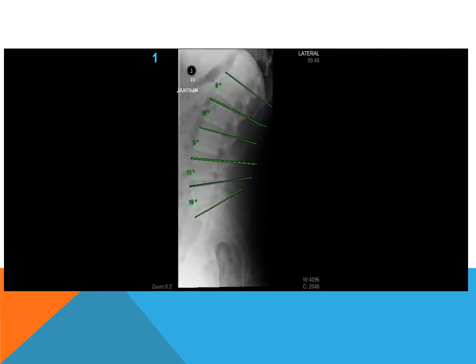So here on the same lateral lumbar radiograph, I measured the lumbar lordosis. It was 60 degrees. I've now measured the intersegmental angles by drawing a line first from the superior end plate of L1 to the superior end plate of L2. That angle measures -8 degrees. And by the way, doctors, you need to be very careful of your pluses and minuses. Minus degrees indicate that the angle is in extension. It's in a lordosis. Negative angle indicates extension lordosis.